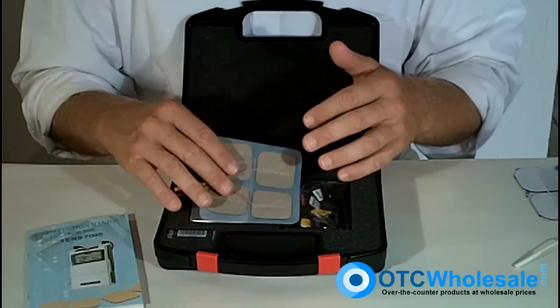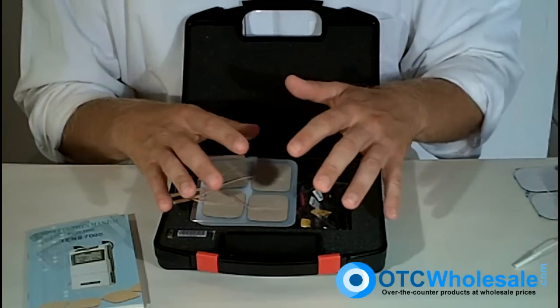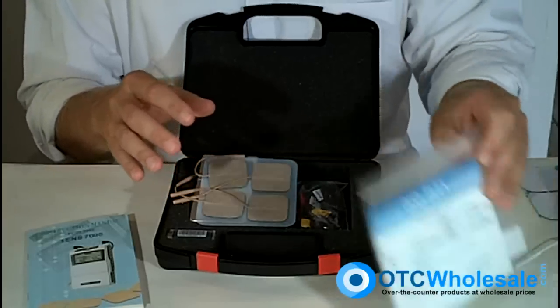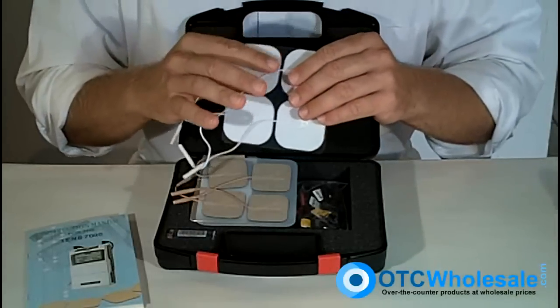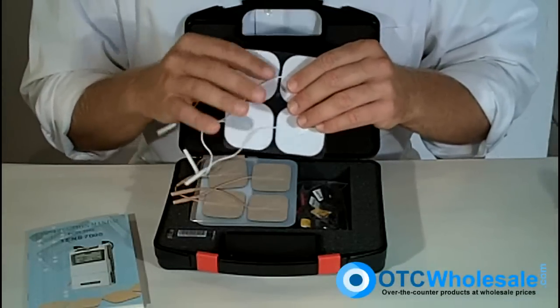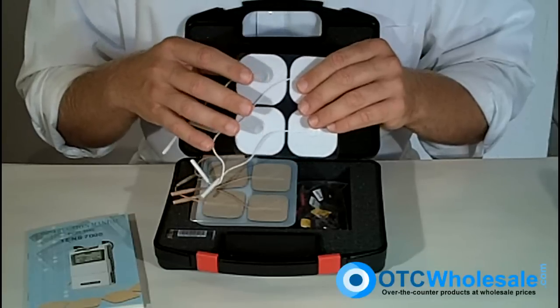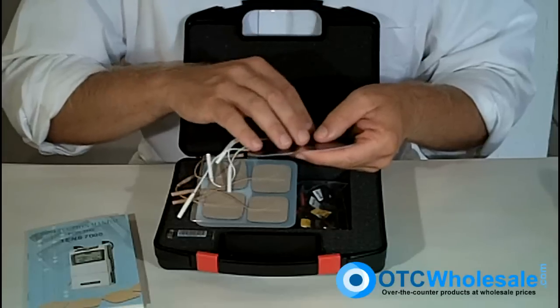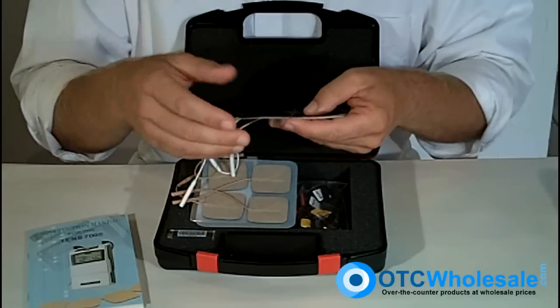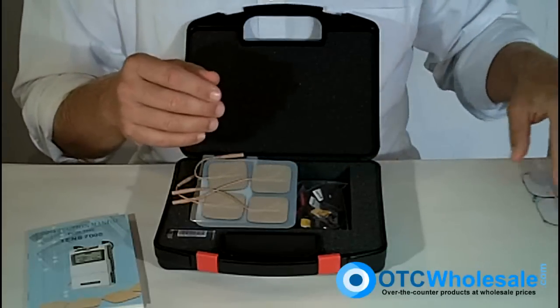I can't stress enough that when you get the unit, you should go ahead and get yourself some decent electrodes — it makes a huge difference. Buy something like a Lead Lock BioFlex 2x2 electrode. These are silver electrodes with a silver backing that distributes the charge across the whole electrode and gets rid of the shocking sensation. It'll have a better American-made gel on it so that it's more reusable. You're just going to be much happier if you spend a few bucks and get a better electrode.